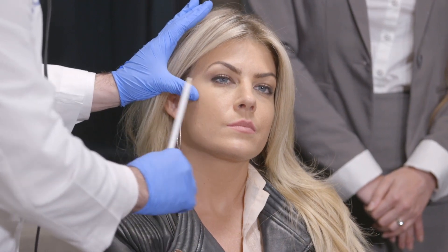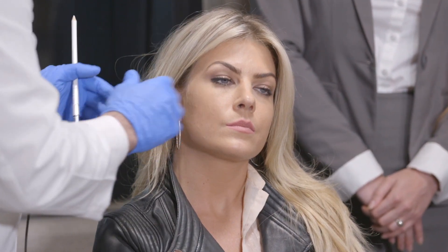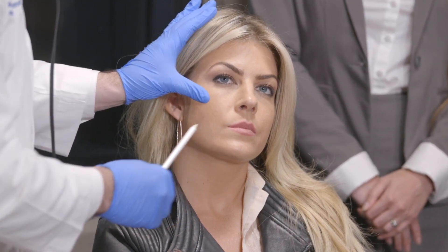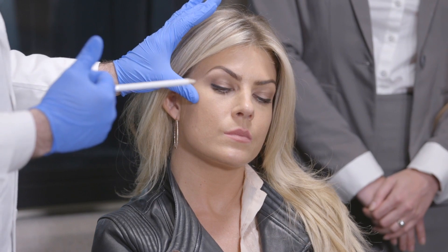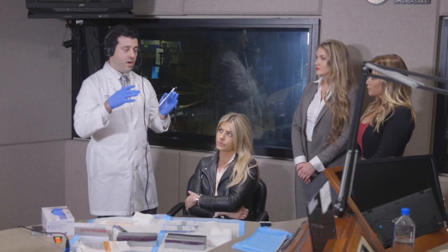As you work your way to the inner cheek, we have loss of volume in this area. She has great features, but with loss of volume things start to sag and work their way downward, and then you start to get deepening of the folds — the nasolabial fold. Our goal is to replenish the volume and to lift and anchor the cheek to give improvement in definition. A youthful face looks like an egg — wider in the midface, more narrow at the lower third. As we age, that egg becomes upside down because we start to sag. The goal is to augment the mid-third so that we have a wider middle third simply by placing volume.